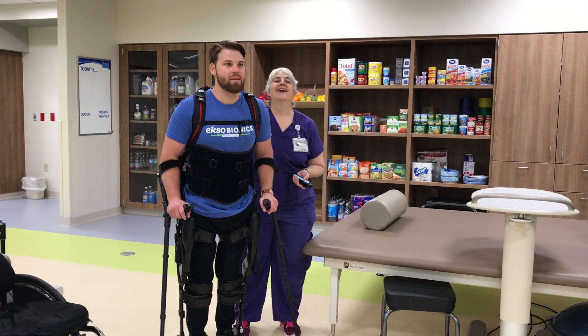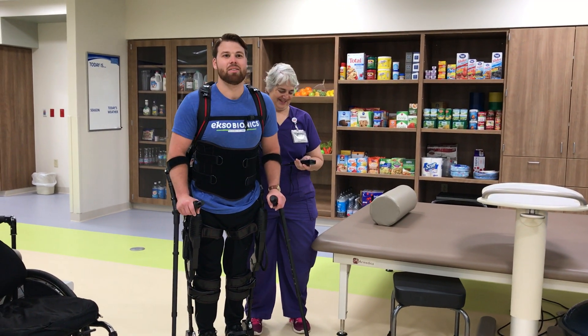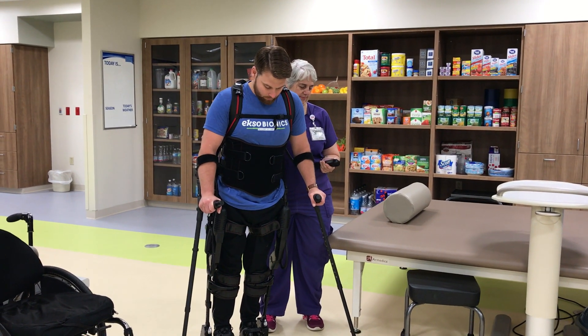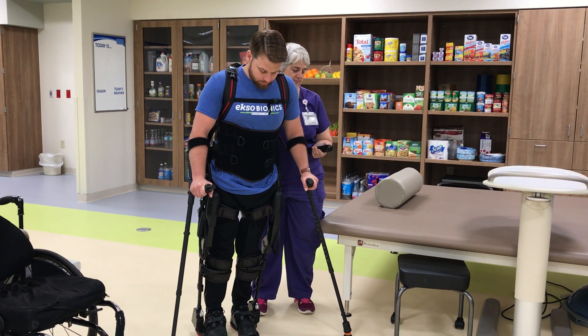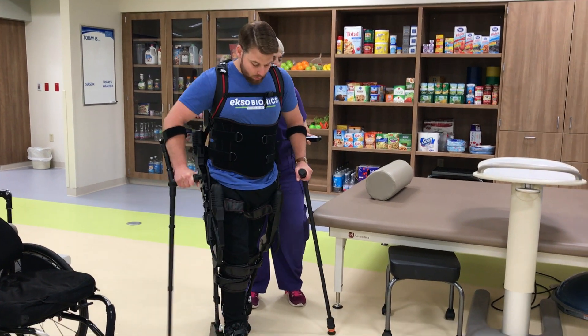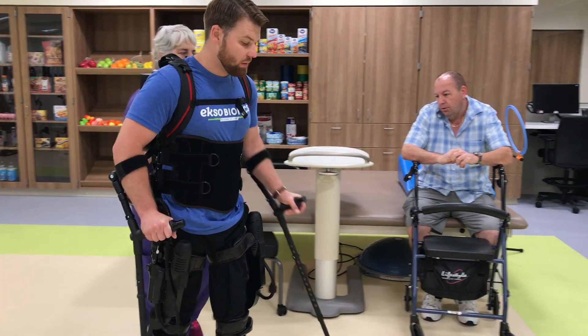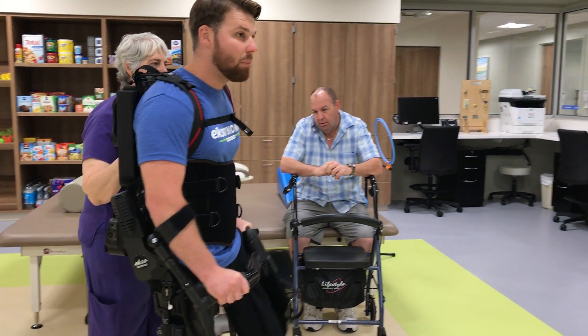How you guys doing? So I have a T12 incomplete spinal injury, which basically means I'm paralyzed from the waist down, but I have some movement in my legs.